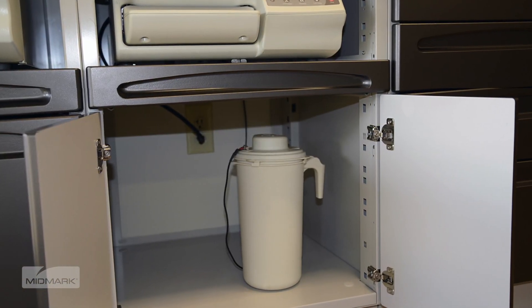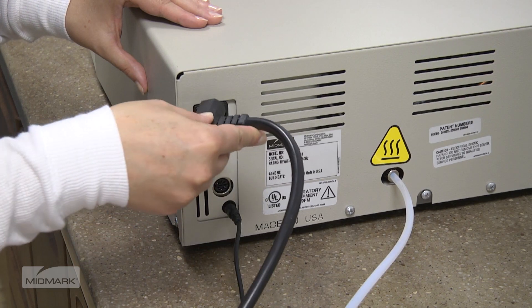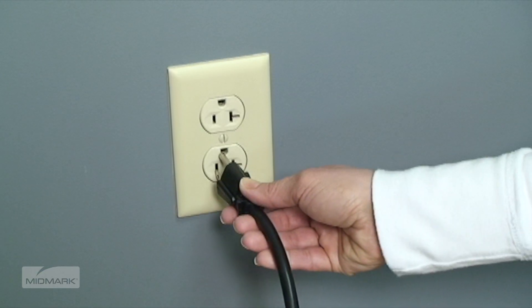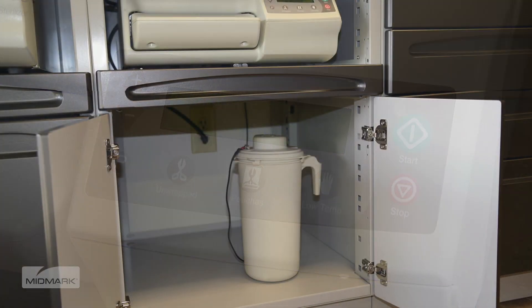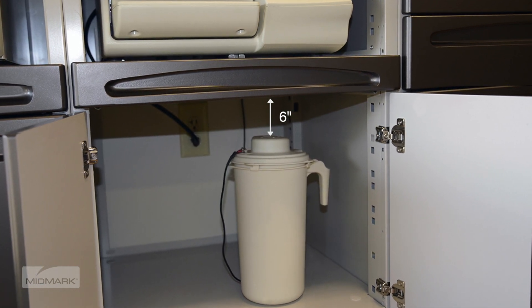Place the tank on a level surface, no higher than the sterilized support surface. After ensuring proper electrical requirements, attach the electrical cord to the back of the autoclave and then into the wall socket. Turn the unit power switch to on. This message will then appear on the display. Maintain a minimum of 6 inches of clearance above the condensing tank for proper steam ventilation.